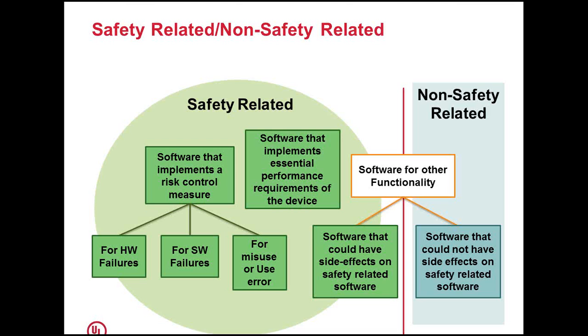And software that implements the essential performance of the device. This means the software which is directly influencing the performance of the device. For example, X-rays, CTs, MRIs, and other products where the software is going to play a critical role in determining the performance of the device. So these things come as safety related.